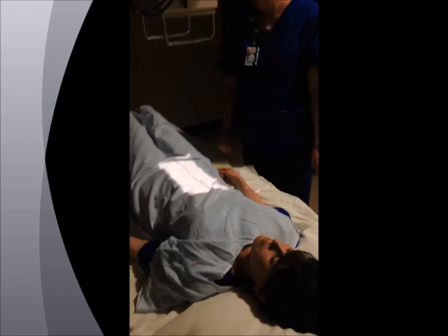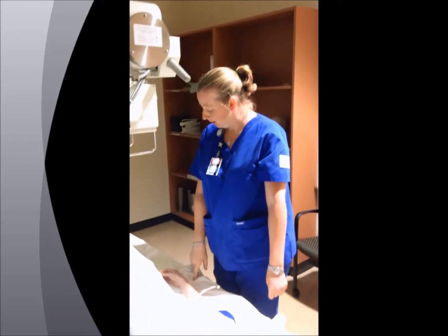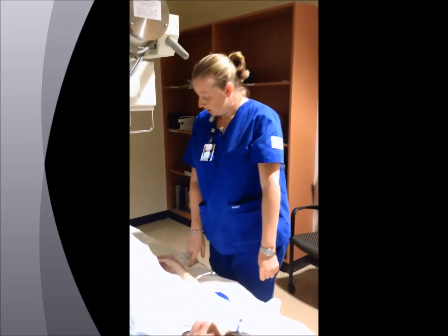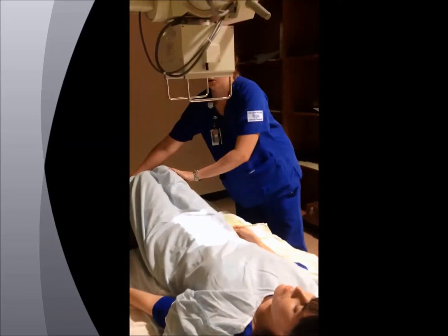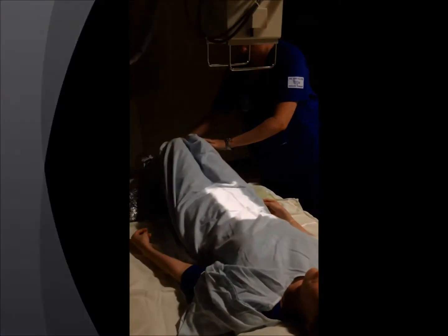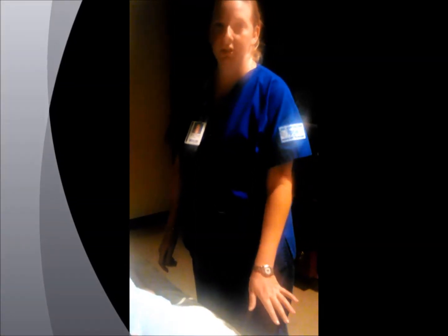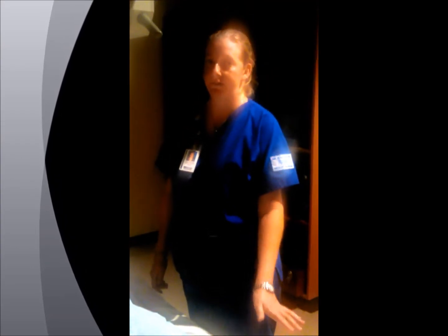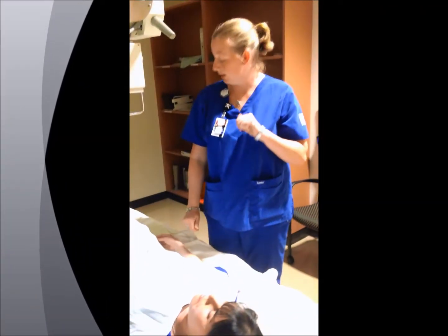Anatomy demonstrated is the lumbar vertebrae, the intervertebral joints, and transverse processes. Make sure the patient's not rotated and they're aligned straight. Before you expose your patient, you want to make sure that you mark the appropriate side of anatomy, and you're going to put it off to the side so it doesn't obscure any anatomy. For the AP position, you're going to use a kV range of 85 to 95 kVp. And you suspend breathing on expiration.